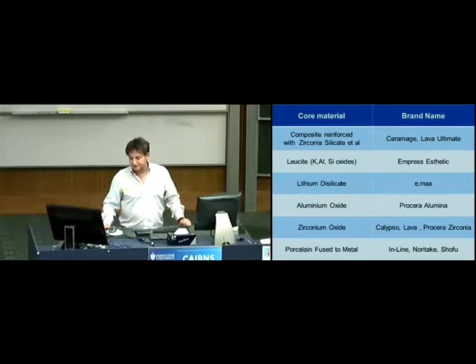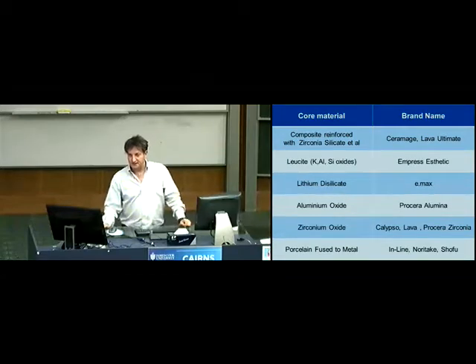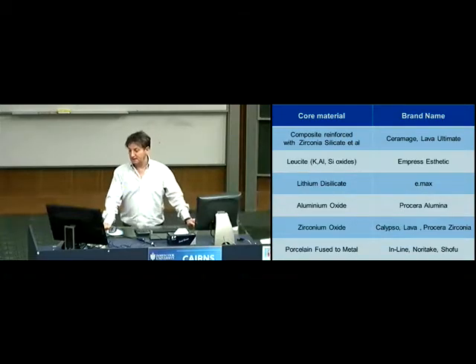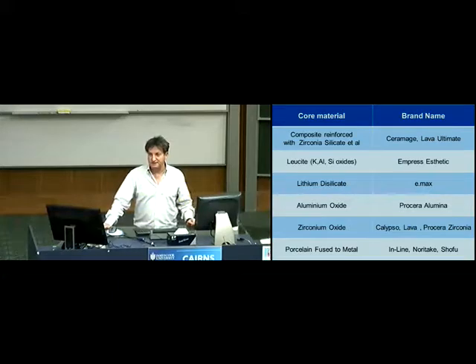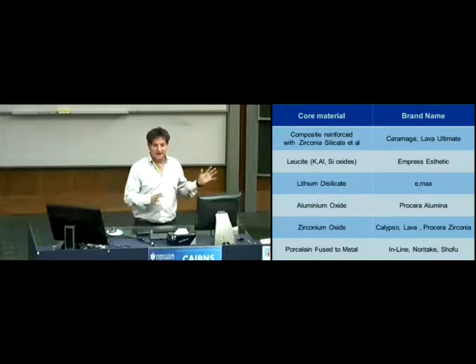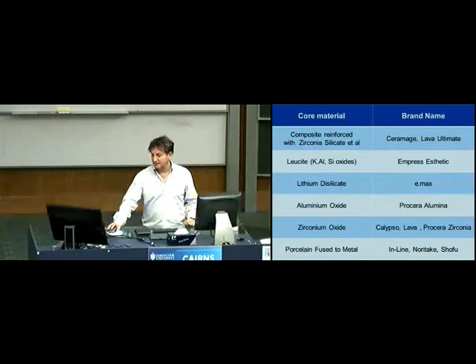Empress Aesthetic is very similar to the old Empress 1, which had a failure rate of about 35% in 6 years. That wasn't the best material we had. Flexural strength was about 150 MPa. Empress Aesthetic is great, and we'll talk about that a bit. Emax is one we obviously need to discuss, and there are lots of different versions of Emax now. I want you to try and understand the difference between them. Remember that Castrol ad, oils ain't oils? Well, Emax ain't Emax either. There are lots of different types, which I'll run through, and I want you to really understand the difference.